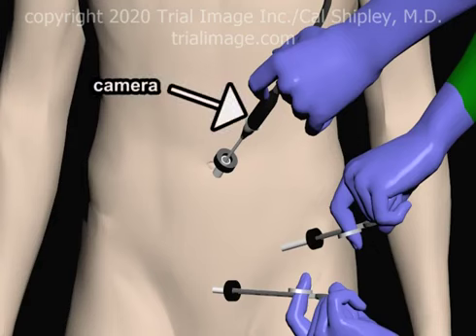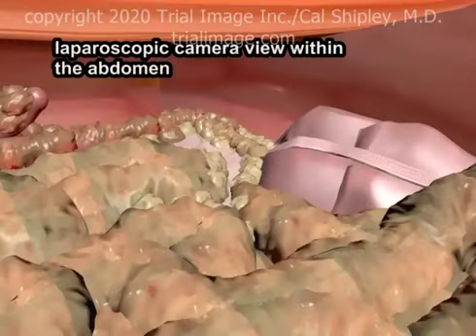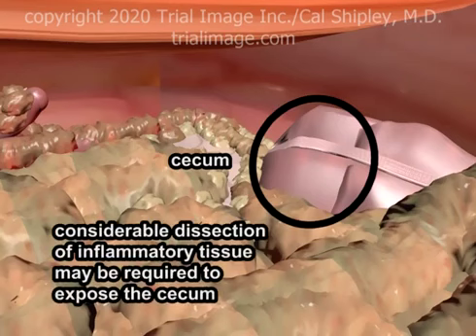The periumbilical port holds the laparoscopic camera, which provides the surgeon and her assistants with a view of the operative field throughout the procedure. Operating room video monitors display the images generated by the laparoscopic camera. Upon entering the abdominal cavity, the surgeon locates the cecum. Depending on the degree of inflammatory reaction around the infected appendix, a fair amount of tissue dissection may be required to expose the cecum.